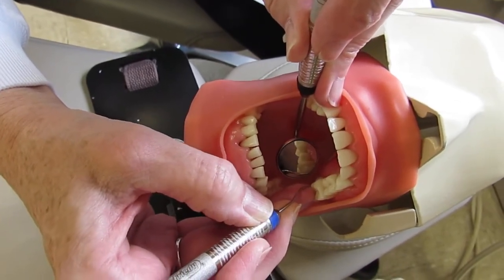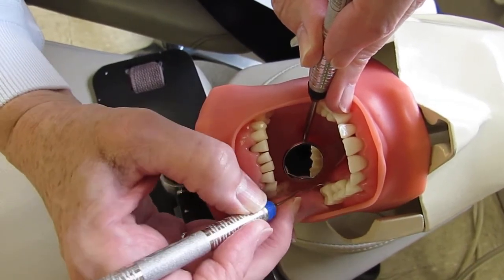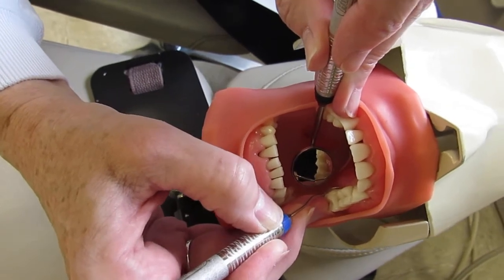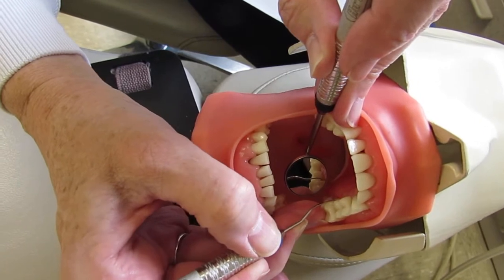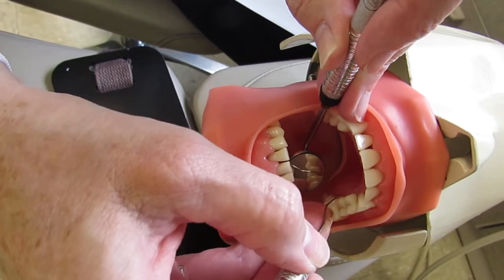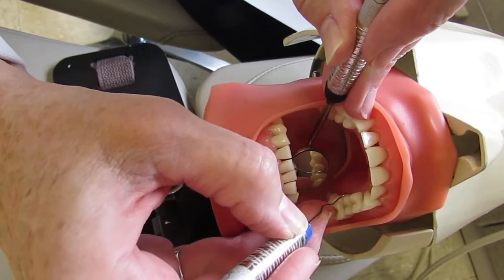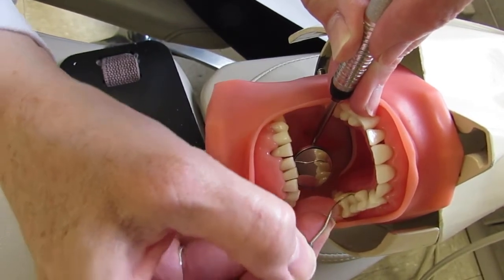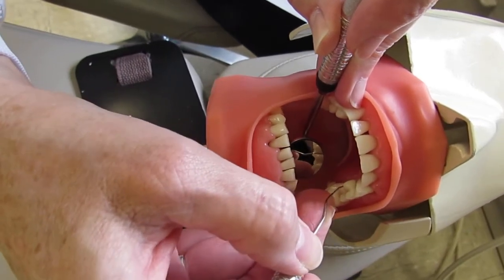Walk the instrument this way, come out, and if needed adjust your hand for the quarter turn — molars are wider so it's a wider span. Walk across the tooth, getting taller on the fulcrum with the shank parallel, then bounce to the next tooth. Come out, quarter turn, insert. Always go into the get ready zone for insertion because it helps confirm correct adaptation to the tooth.